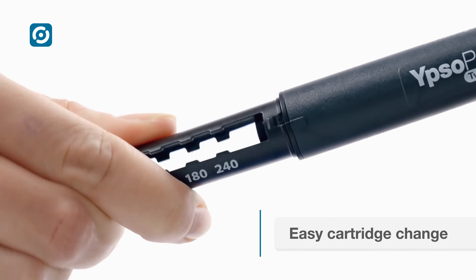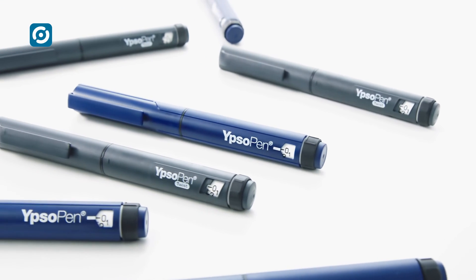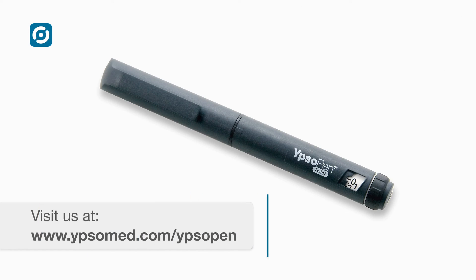Ipsa Pen is ideal for insulin and other therapies with variable dosing. The pen color and printing are adjusted to meet customer requirements. Ipsa Pen — the intuitive dial-and-dose reusable pen with a lifetime of three years. The perfect match for price-sensitive markets.